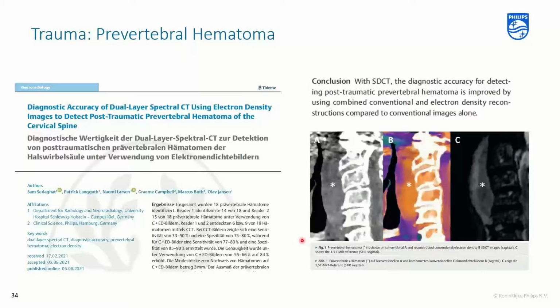Also, what's interesting in trauma patients is that you can detect the fracture of the spine, but what about the surrounding tissues? If there's a chance that there might be a hematoma, for example, a bleed, that isn't being reabsorbed and could need to be operated on, this is again a case where further imaging is needed. An MRI is probably done.